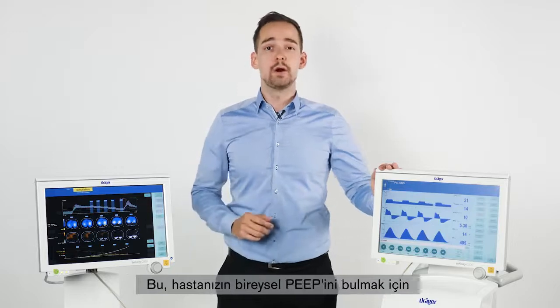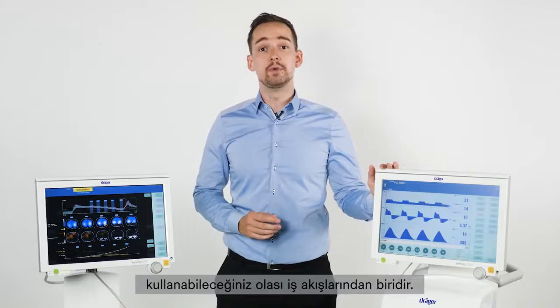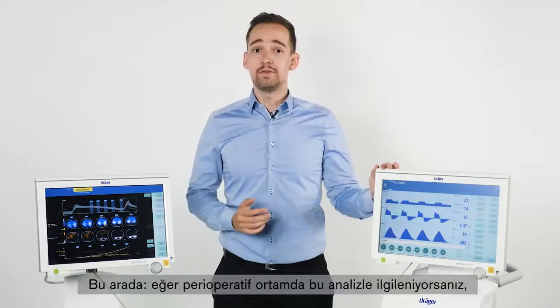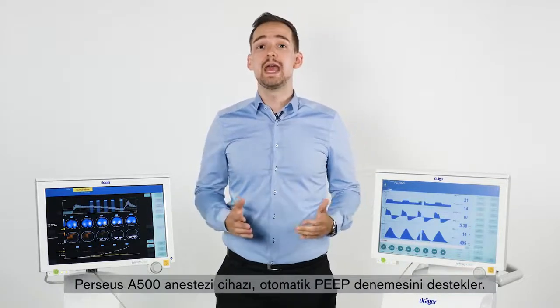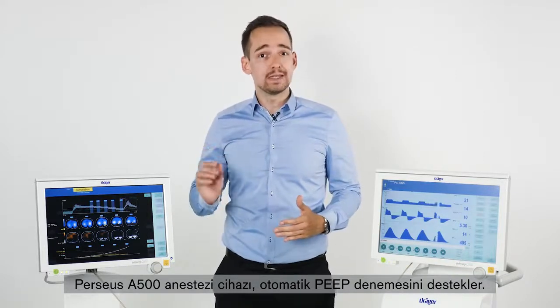So this is one possible workflow on how to find the individual PEEP for your patient. By the way, if you are interested in this analysis in the perioperative setting, the Perseus A500 anesthesia device supports an automated PEEP trial.